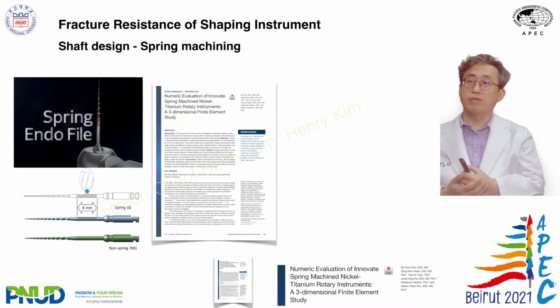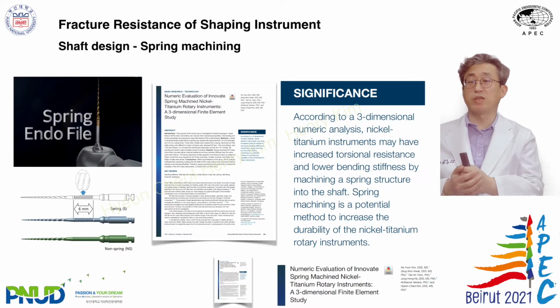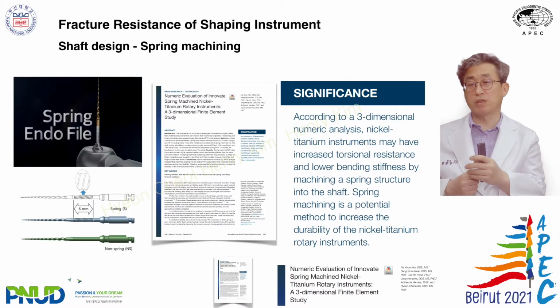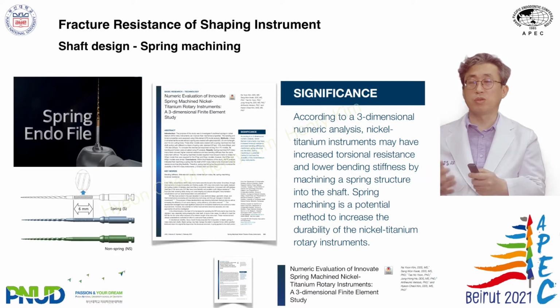In the result of finite element study, this is the first one, the finite element file models with the spring were shown to have higher torsional strength and better fatigue resistance. So we concluded the spring machining may increase the mechanical durability of the instrument while we use inside root canals. That is computer simulation.